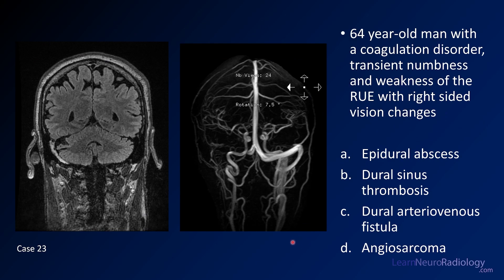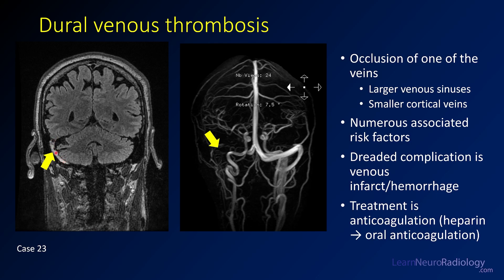Case number 23: a 64-year-old man with coagulopathy, transient numbness and weakness of the right upper extremity, and some visual changes. The left image is a coronal FLAIR; the right is a MIP from an MR venogram. Choices are epidural abscess, dural sinus thrombosis, dural AV fistula, or angiosarcoma. The answer is dural sinus thrombosis. On the coronal FLAIR, there's abnormal hyperintensity in the sigmoid sinus where you'd normally see a flow void. The venogram shows truncation of the transverse sinus, with no sigmoid or transverse sinus on that side. A complication is venous infarct or hemorrhage — think about this if you see unusually distributed hemorrhages around the posterior temporal lobes.